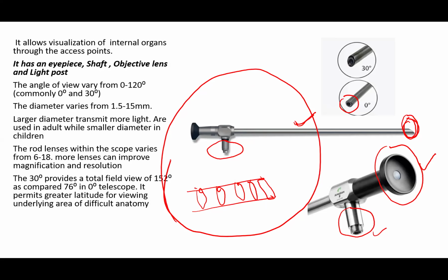This is a very important aspect of laparoscopic surgery, because if the assistants don't know how to hold and follow the camera, the surgeon will suffer, and the entire procedure will be very lengthy. So there is a particular technique of holding the camera, which we'll discuss in detail.